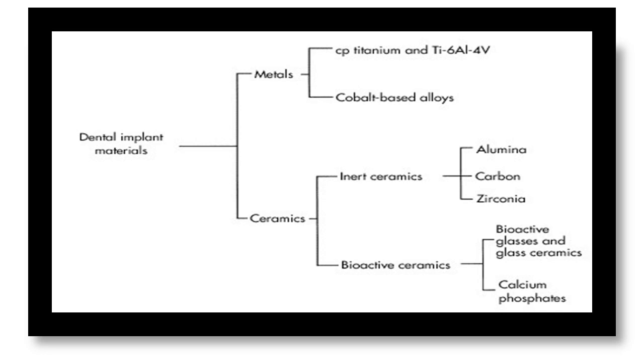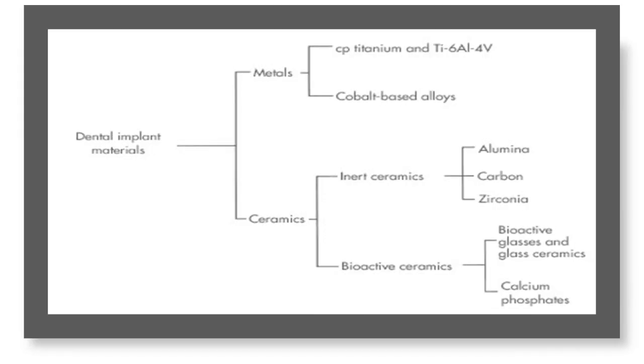The inert ceramics are alumina, carbon, and zirconia, whereas the bioactive ceramics, as the name suggests, bring about a reaction at the bone and implant surface interface, and they cause bone deposition over there. So these are the bioactive glasses, glass ceramics, and the calcium phosphates.